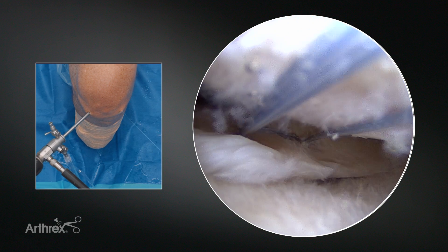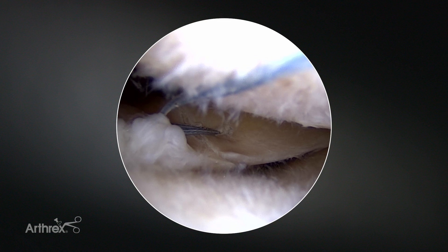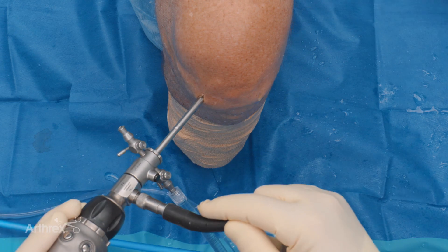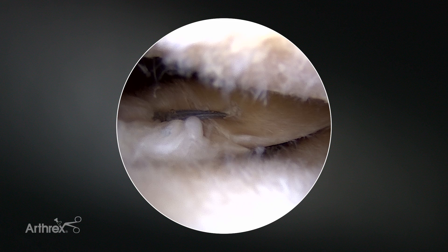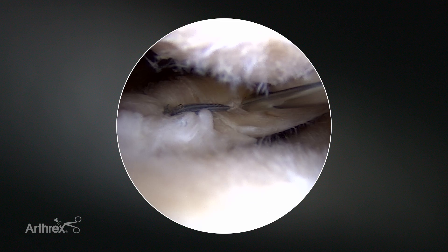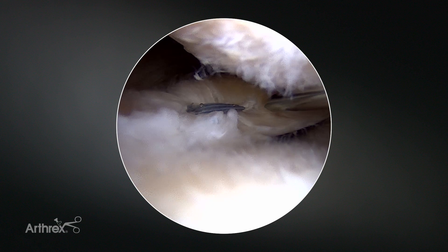That would be a typical way to address these root equivalent type or radial tears way posterior in the lateral meniscus. Typically in this kind of tear, I would like two traversing the tear and then maybe one underneath. So I kind of want to space my puncture points out and not have them in line so I don't have a little stress riser.